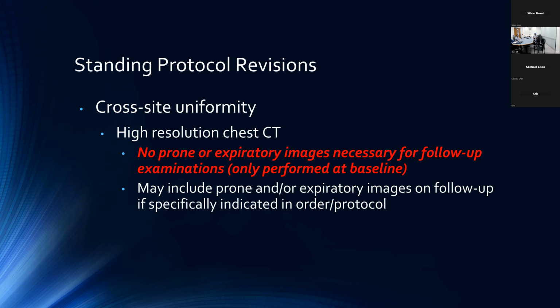Really, the follow-up exam can be performed with only supine and inspiratory imaging, unless it's specifically indicated otherwise somewhere in the order or protocol, which generally it's not. So those follow-up exams really don't need those additional prone or expiratory images. The supine alone is sufficient.